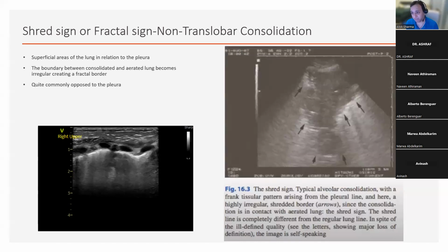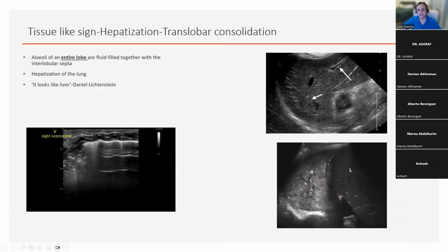Pretty much, I'm letting you know that I've done lung ultrasounds at 20 minutes where I've had fully aerated lungs with A profiles in all segments, in a baby who was grunting at birth, who's just come to the neonatal unit 20 minutes later after having a cuddle with mum, and actually has A profiles everywhere. So transition can be very, very quick, as quickly as 10 minutes. Transition can also be quite delayed. And this is really important when we talk about RDS, but I'll come to that. Any other questions?